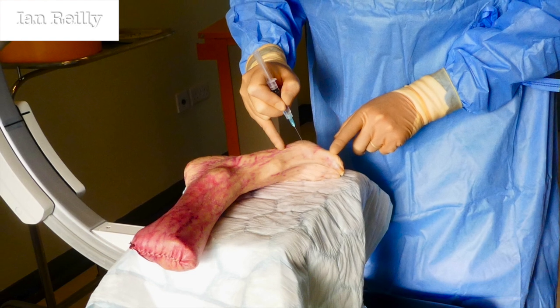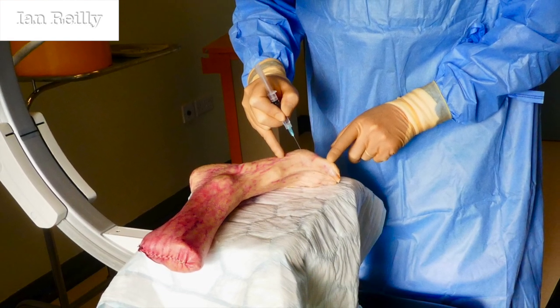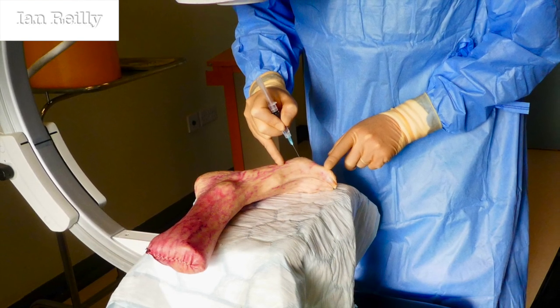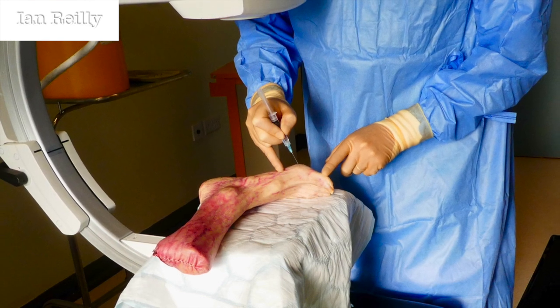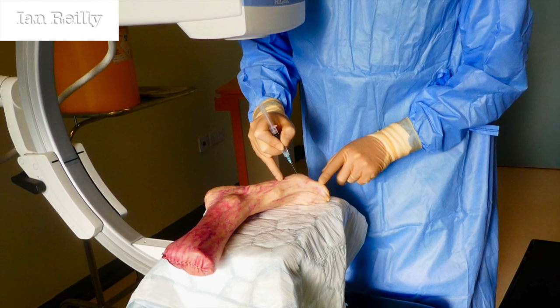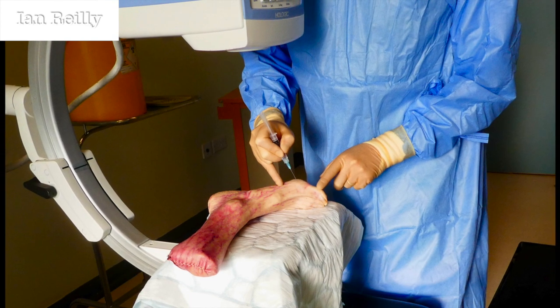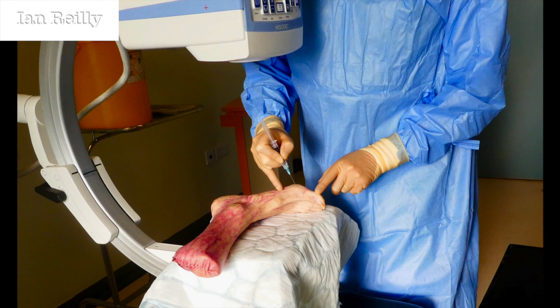So this is some work I've done on cadavers. I'd look to try and develop a best practice first MTPJ joint injection technique, and then I wanted to prove that it was easy to do using palpation guidance. Here you see a foot chopped off mid-shin, and I'd put in some radio opaque dye under an x-ray machine to see where the injectate had gone, to try and prove the injection was accurate.